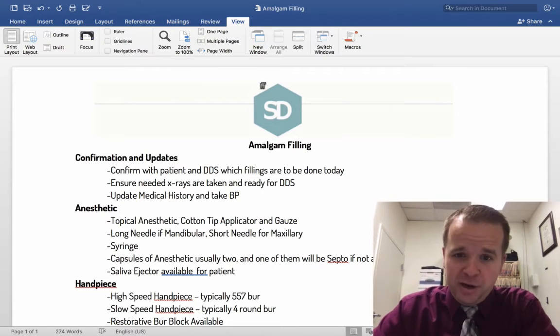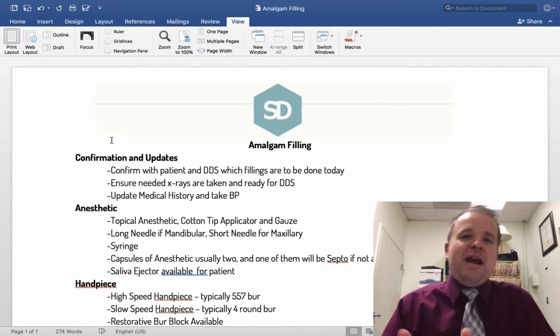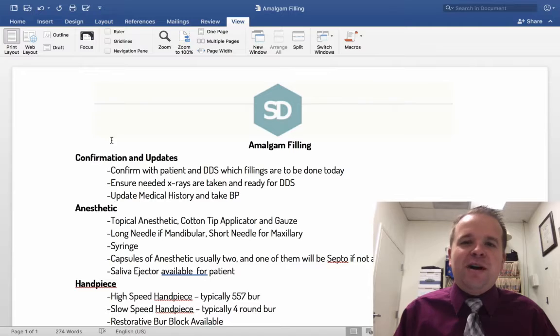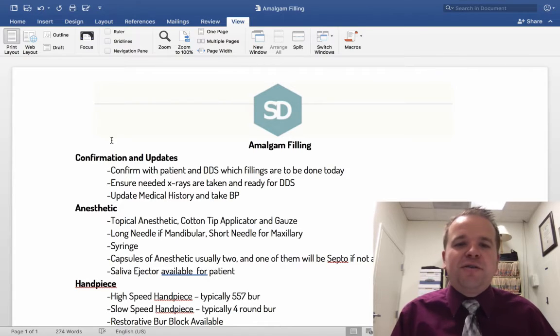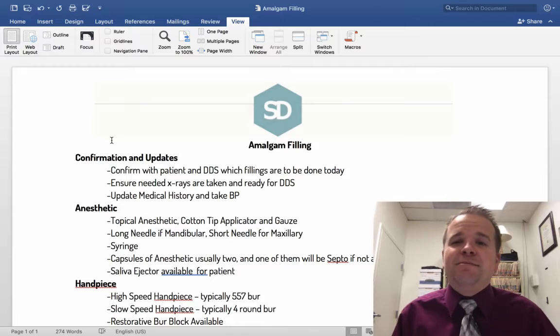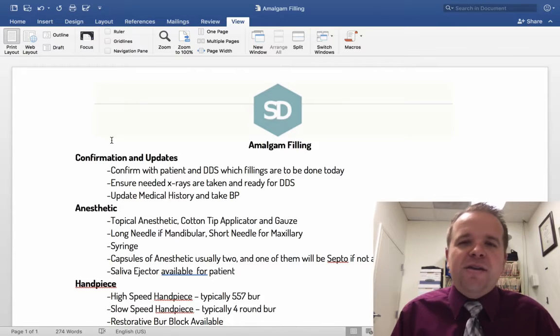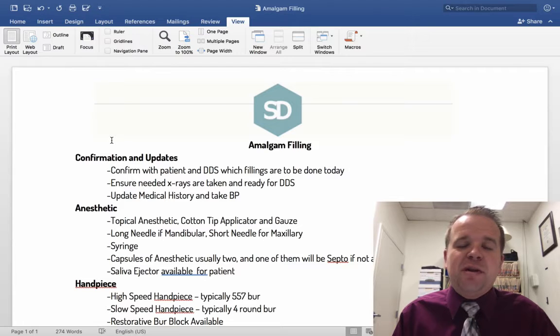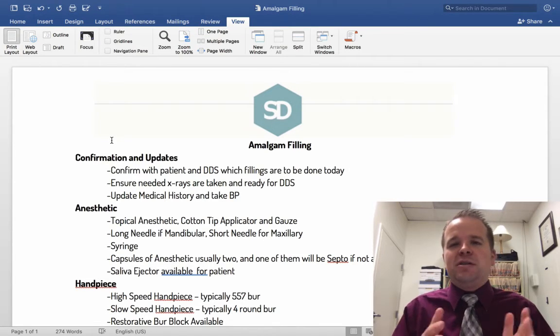But here we go. So, amalgam filling. The first thing we're going to try and do when everybody comes in for a routine procedure, filling, crown, that type of thing, is we're always going to make sure that the patient, you, and the doctor are all on the same page. So the first thing we do when a patient sits down is I'll say, "So, Mrs. Mickey Mouse, we've got a filling planned on tooth number on your upper right side." And they say, "Oh, I thought we were doing the lower left side today." And then you can look at their treatment plan and see that there's some fillings down there. There might have been a mistake in who scheduled the treatment, but we're going to make sure that the patient, you, and the doctor are on the same page.